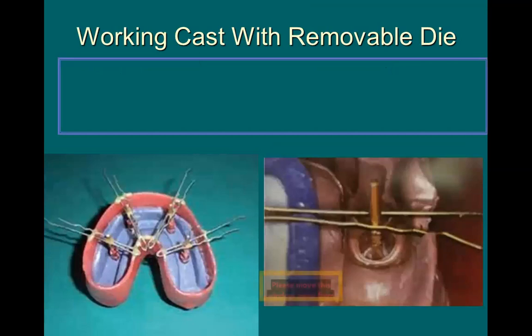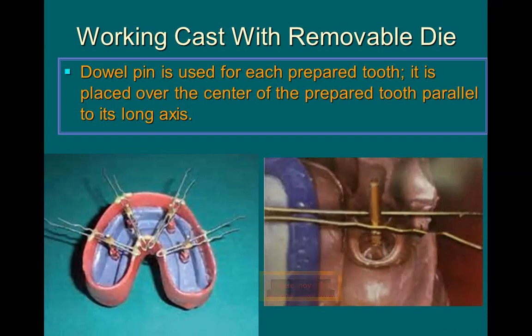عملية صب الإمبريشن مع وجود داول بن: أولا نثبت الداول بن بطريقة مثل قضيب معدني أو خشبي. نحاول نثبت الداول بن بحيث يقعد في موقع الإمبريشن اللي هو السن المحضر بصورة عمودية وبارلل للونج أكسس. إذا كان عدة داول بنز لازم تكون كلها متوازية، ما يصير واحد أعوج والآخر عدل. حتى في حالة يكون عندي بريدج، يطلع هو والداول بنز مالته بصورة كاملة ويقعد في مكانه. مثل ما عرفنا، الداول بن هو الجزء اللي يسهل خروج الريموفبل داي من الكاست.